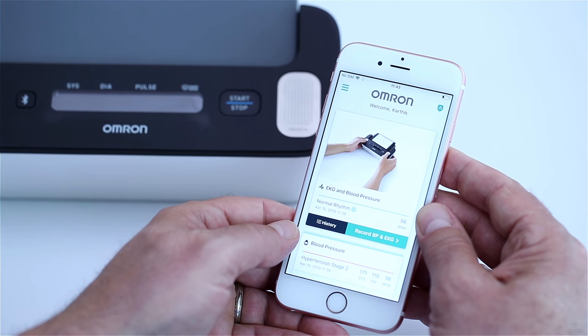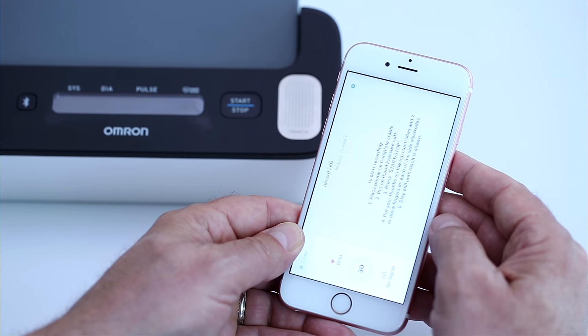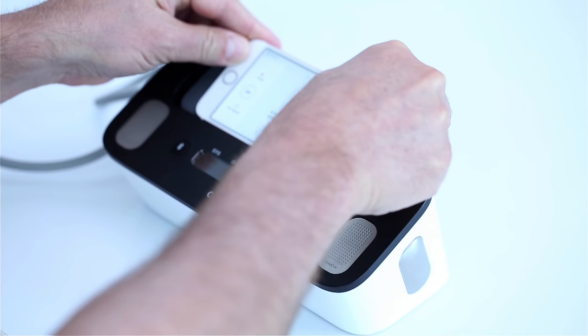Step 5. Open the app on your smartphone and select Record BP and EKG. Turn the phone into landscape orientation and place it on the smartphone cradle.